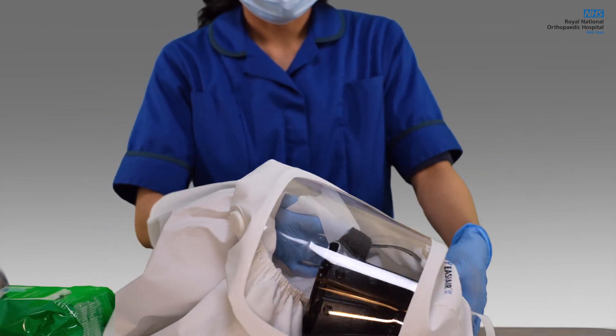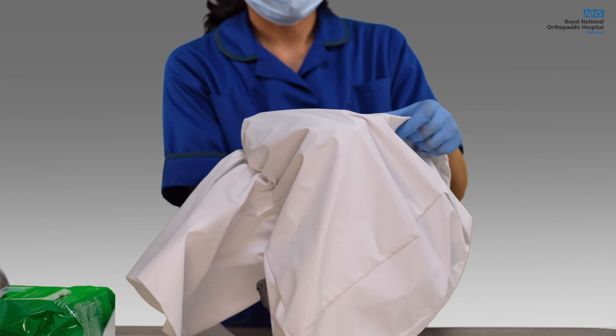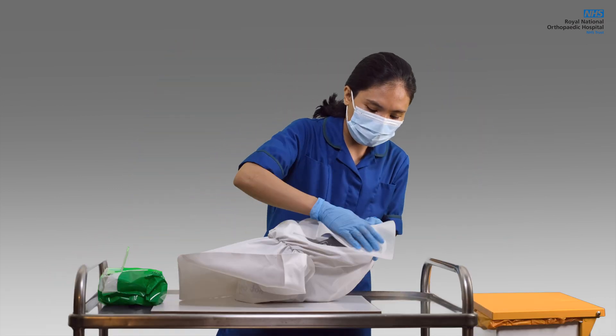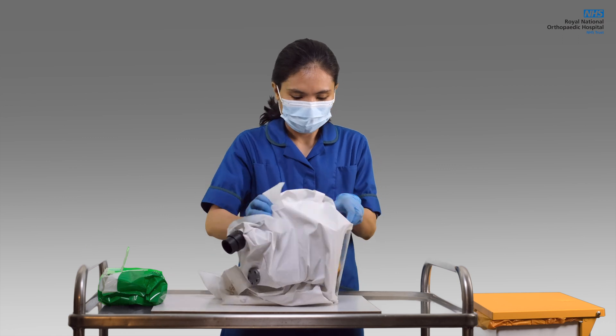Next, always use one fresh wipe for the inner portion of the hood. Make sure not to use the same wipe for the other parts of the unit to avoid contamination. Lastly, clean the outer part of the hood, making sure all the creases are covered. Then gently put it aside to dry, ready for next use.